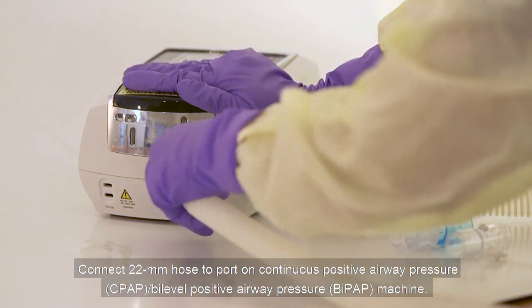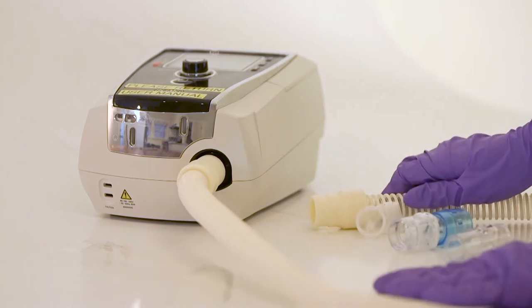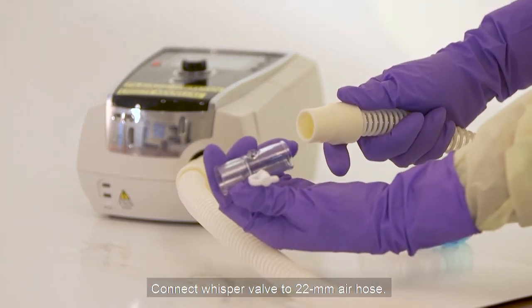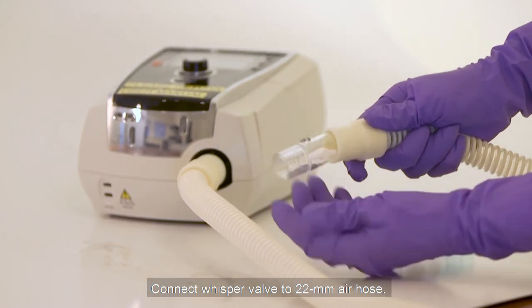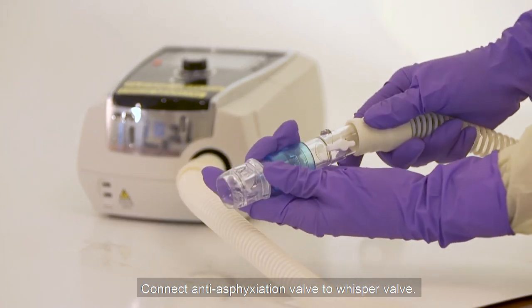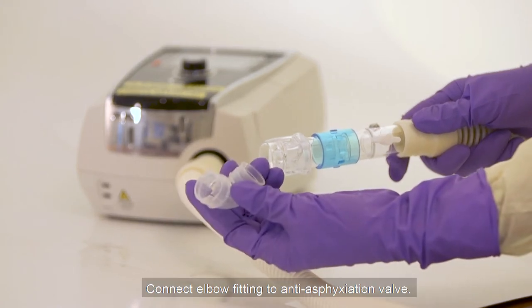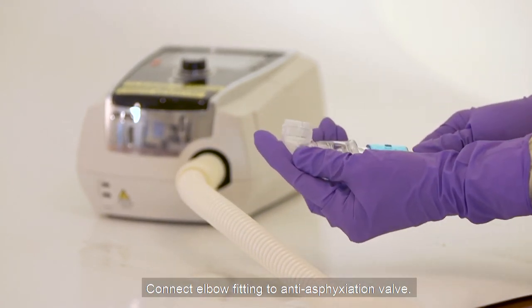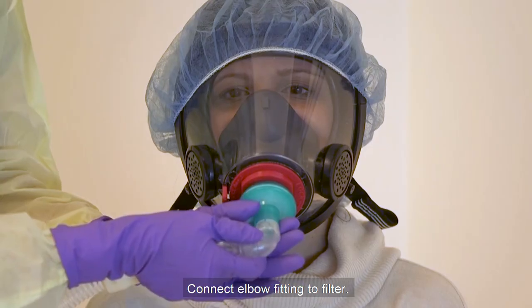Connect the 22mm hose to the port on the CPAP or BiPAP machine. Connect the whisper valve to the 22mm hose. Connect the anti-asphyxiation valve to the whisper valve. Connect the elbow fitting to the anti-asphyxiation valve. Connect the elbow fitting to the filter.